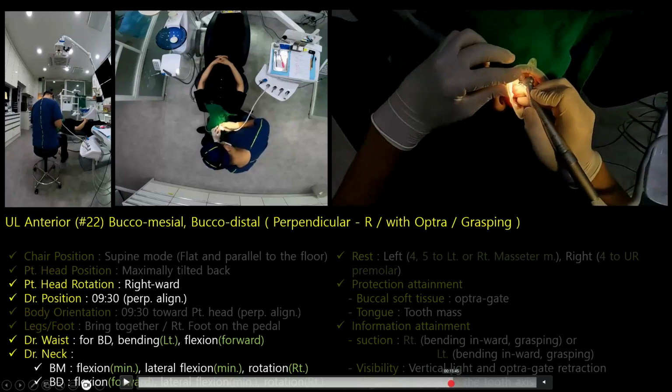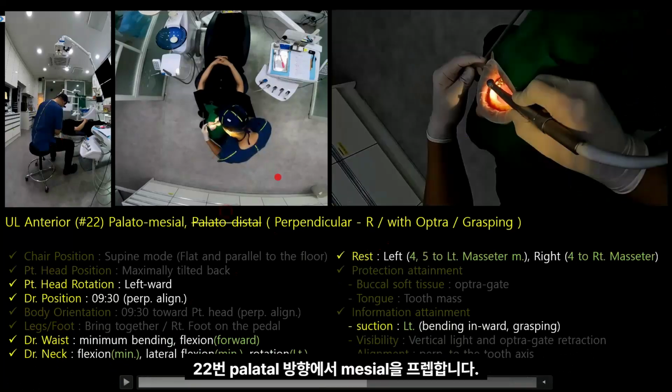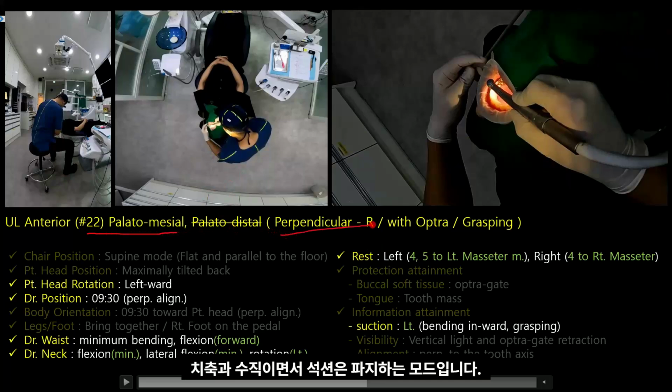Prepping the buccal distal area. Prep tooth number 22's mesial from the palatal side. Perpendicular to the tooth axis, the suction is in grasping mode. Positioned at around 9 o'clock, I'm looking toward the patient's head. The patient's neck is turned as far to the left as possible.